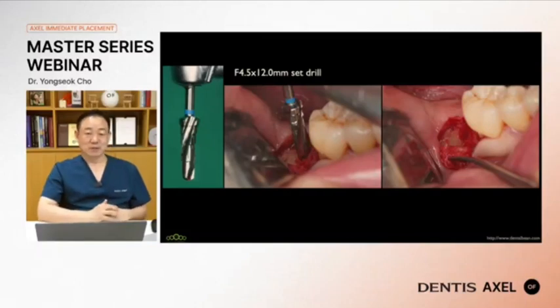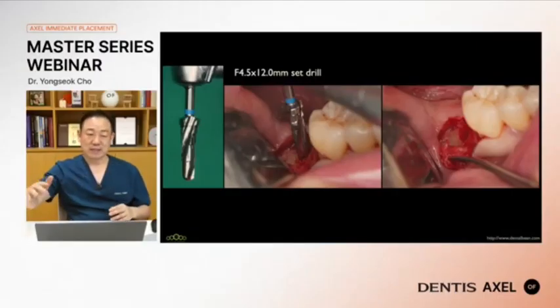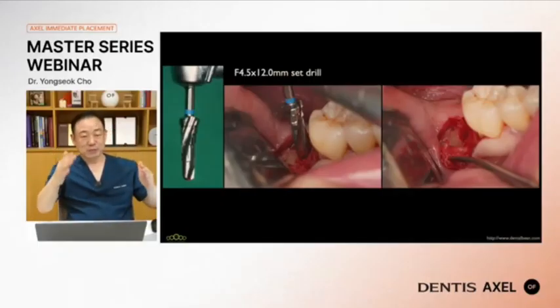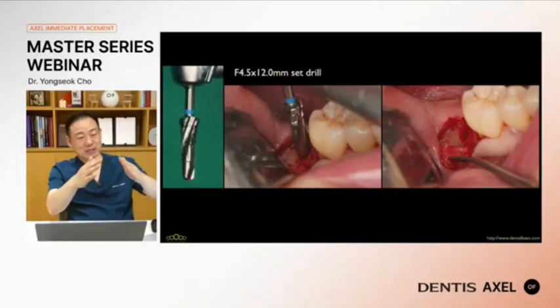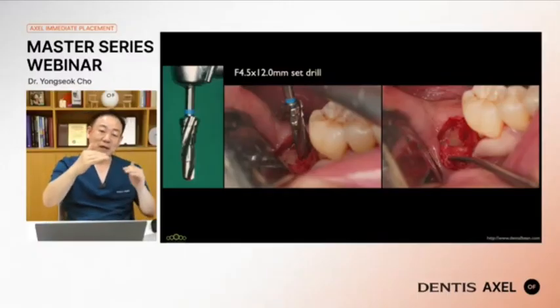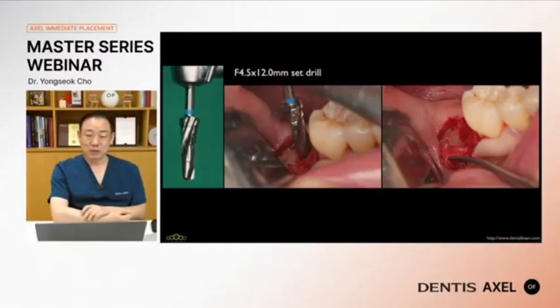Okay, and the second problem is with the bone of number 7. In many late implant cases at number 7, the bone is not flat. Many bones are like a triangular shape, especially the buccal side is much more resorbed. So there is a difference of proximal height and buccal height at the finishing osteotomy.